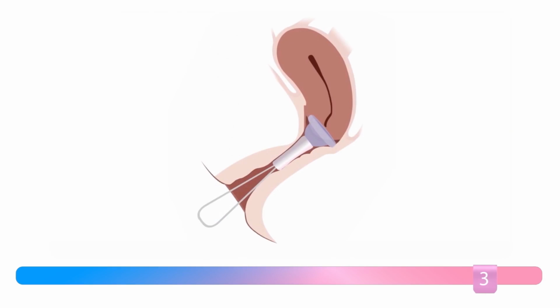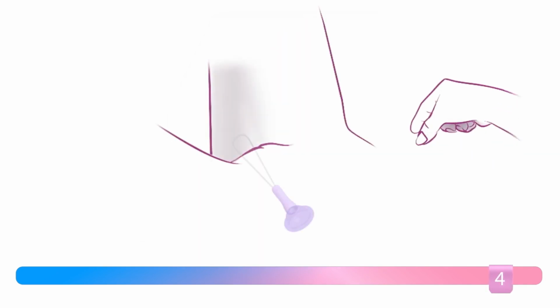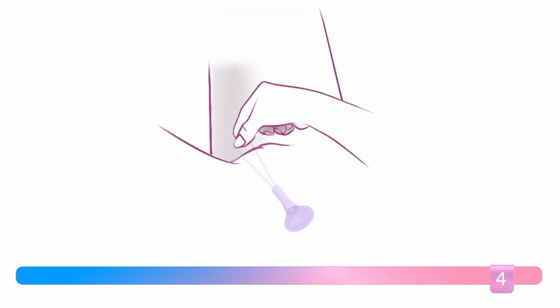The Stork OTC allows you to continue with normal activities. Get out of bed and have fun. Do not have intercourse again until you've removed the cervical cap. Step 4. After 4 to 6 hours, remove and discard the cap.